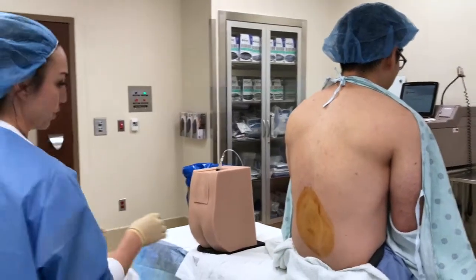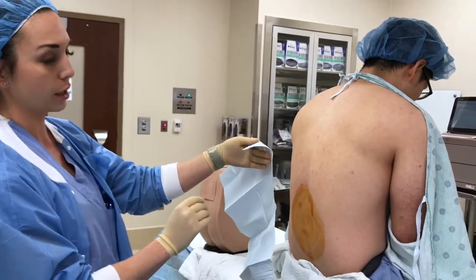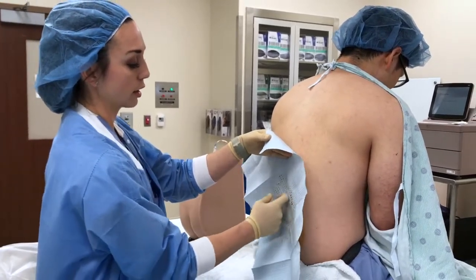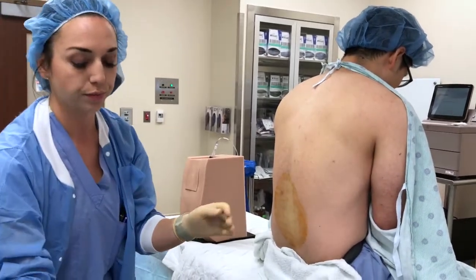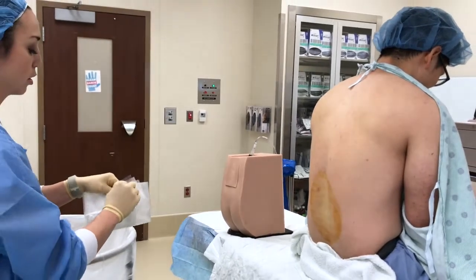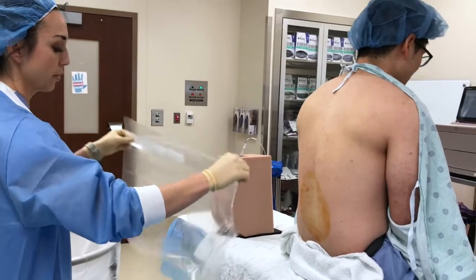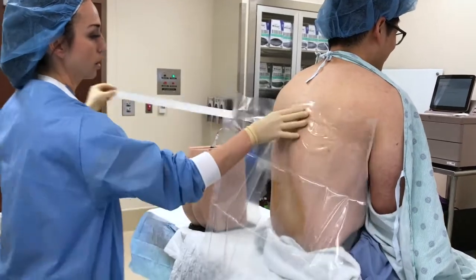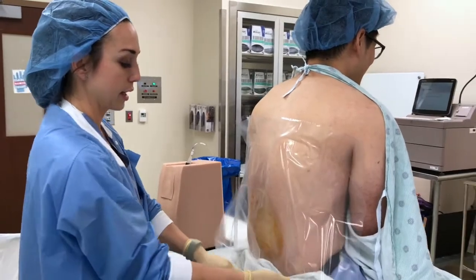All right, very good. All right, use this drape again, just like the C-section video. I want to make sure that you're not contaminating yourself or your field, and so I lightly dab it with the back of my hand. Like this, making sure to try to get in the middle so you don't have any more remainder than you need to. All right, then we're going to place our plastic drape. All right, we've got a cold plastic drape on your back. Make sure good contact. And I like to kind of tuck it in down here.